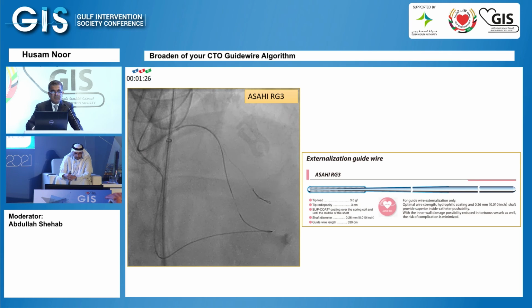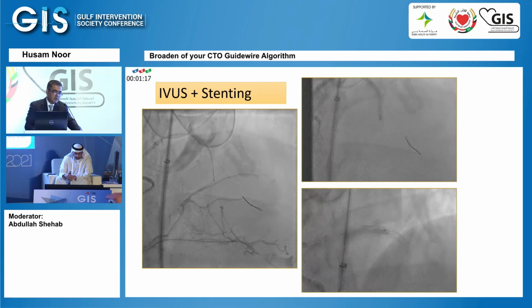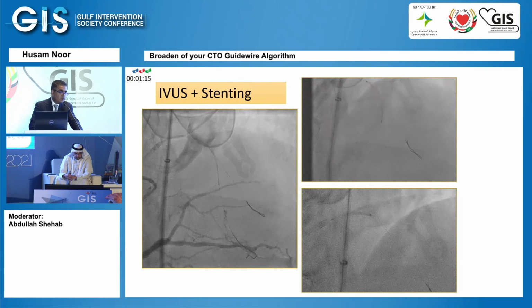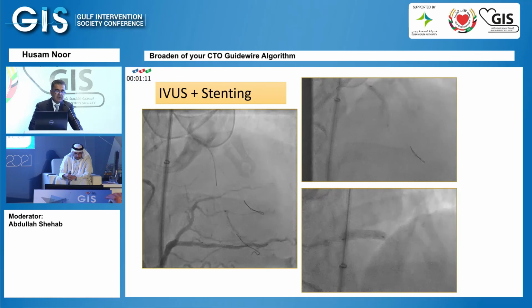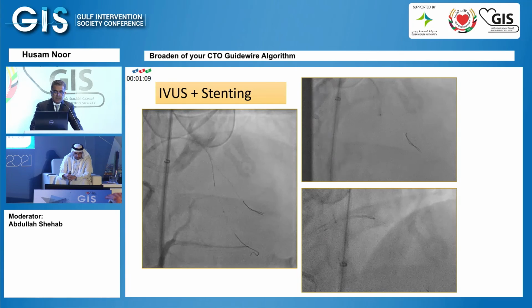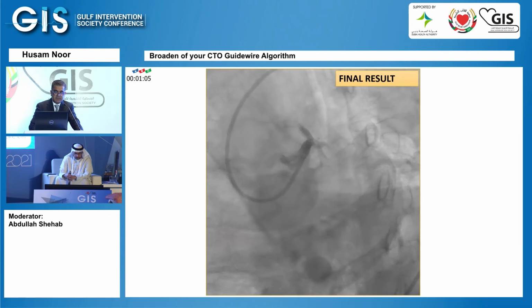And then we exchange the procedure from retrograde to antegrade, and we did PCI as usual. In almost all of our CTOs, we use imaging. Specifically, we use the IVUS, balloon, stent, and this is the final.